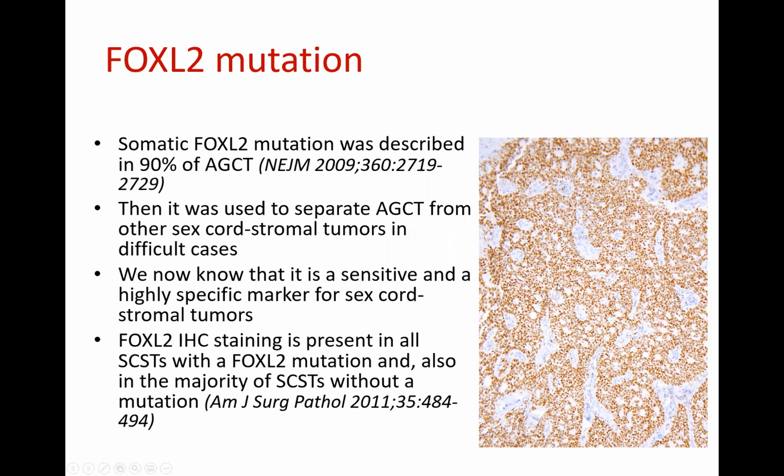The slide you see here is FOXL2 IHC, and this is a case of granulosa cell tumor. And I can tell you, we know that 90%, let us just say all granulosa cell tumors are going to be FOXL2 positive. In other words, if the case is FOXL2 negative, it cannot be granulosa cell tumor. I can say that much. Let me repeat that statement again. If a case is FOXL2 negative, then it cannot be granulosa cell tumor. But if it is positive, it could be granulosa cell tumor, but it could be thecoma, for example, or it could be other stromal tumors, but it will not be a carcinoma, for example.